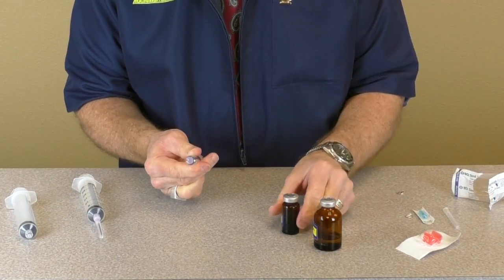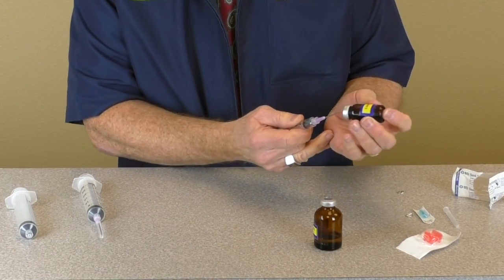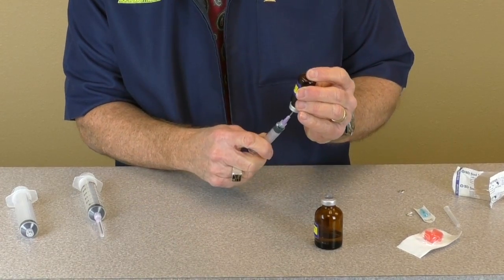Take the 5 ml syringe and withdraw the desired amount from the antibiotic vial and inject it into the poloxamer vial.